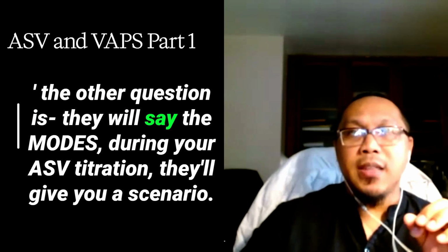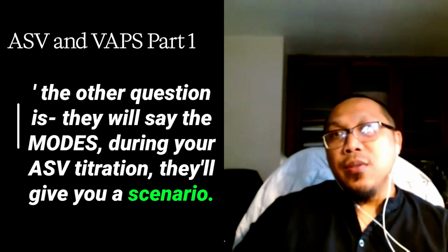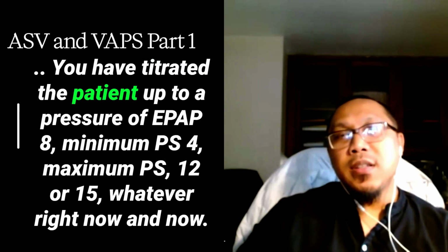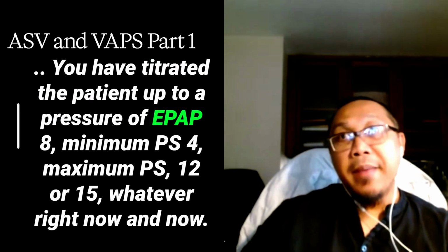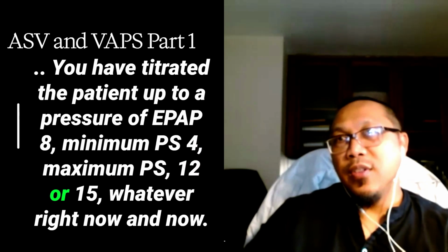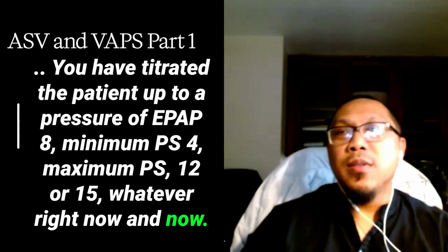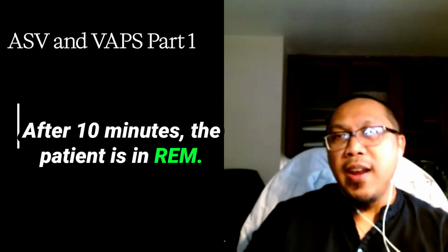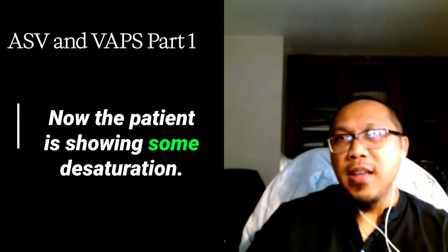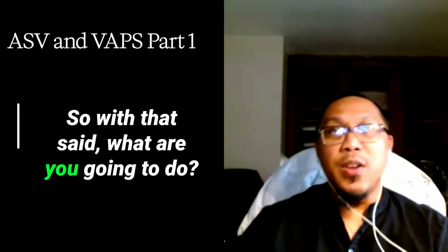You got it? The other question is they will say the mode. During your ASV titration, they'll give you a scenario. You have titrated the patient up to a pressure of EPAP 8, minimum pressure support 4, maximum pressure support 12 or 15, whatever, right? Now, after 10 minutes, the patient is in REM. Now the patient is showing some desaturation. What is your next step?